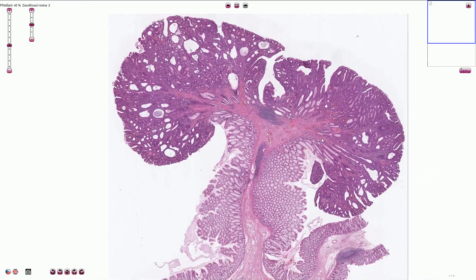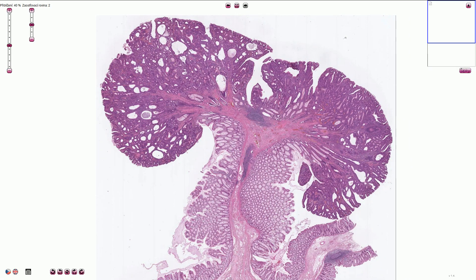We have two types according to architecture: tubular and villous adenoma. This polyp is a tubular adenoma because the crypts are mostly tubular. On the cross section we can see round shapes; on the longitudinal section they look like small tubes. The villi look like these leaf-like structures — for example, here we can see one villus. If both components each represent more than 25% of the polyp, then we can call it a tubulovillous adenoma.